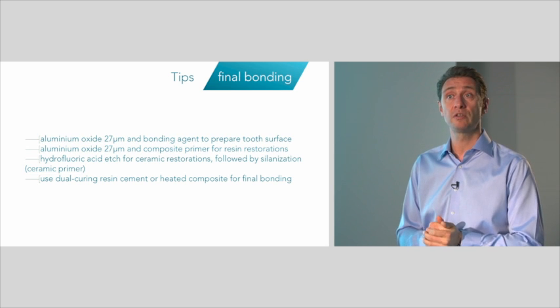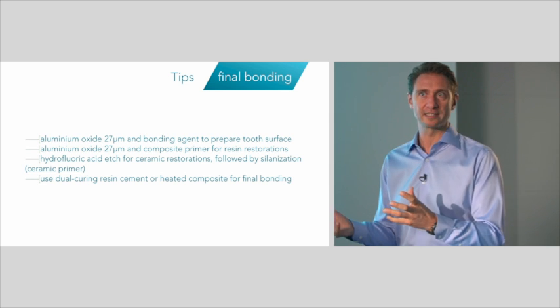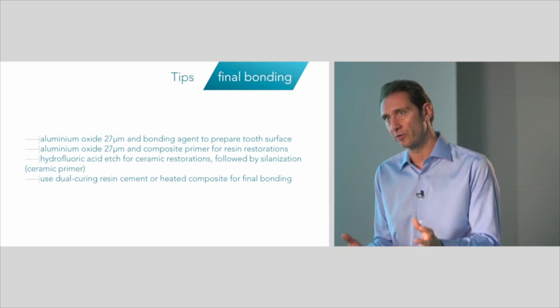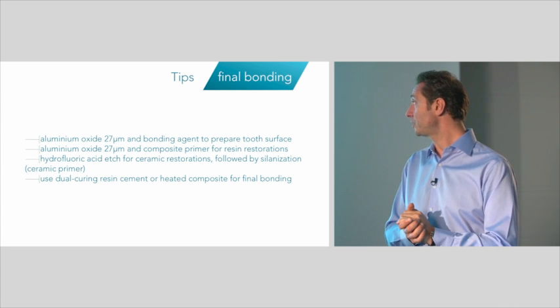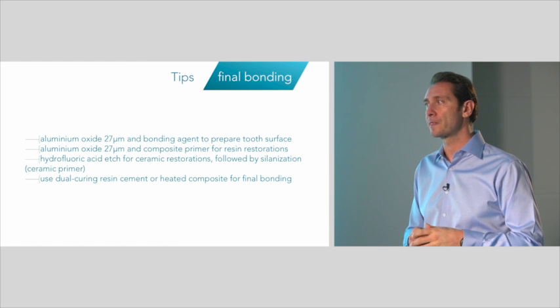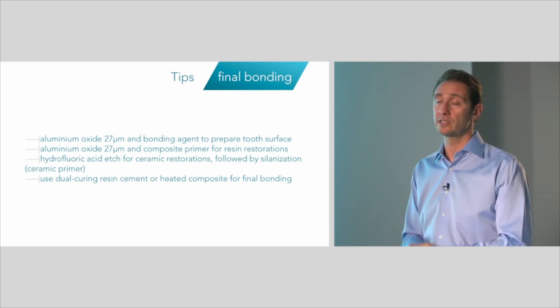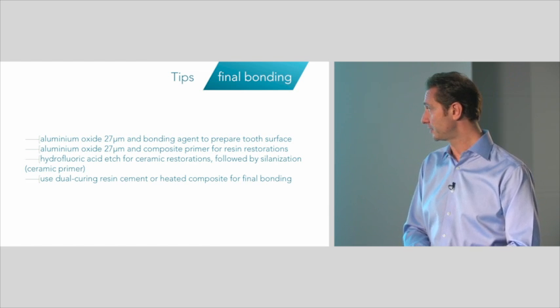final restoration, you have the advantage of having done the core buildup with Everx, so you have the reinforcement coming from the core, and then you have the top layer in the other material, creating, as we showed in the beginning, a complete complex that has a very good and very high load-bearing capacity.